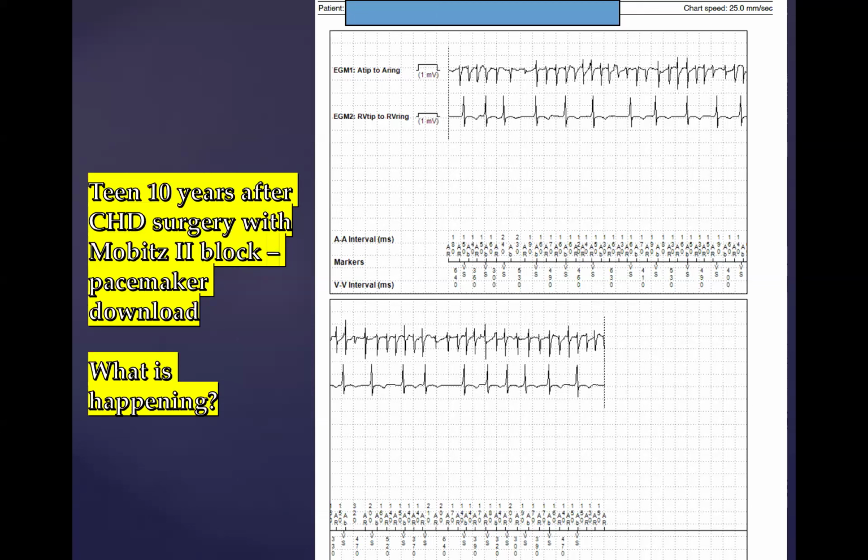Why do you think it is, Molly, that he doesn't know when he's in it? Because he has a pacemaker. Well, let me ask somebody who has heart block anyway. I don't know what his baseline pacing is, but in this tracing, is he actually pacing? No, not at all. His baseline is that he conducts on his own about 85% of the time, and rarely does not conduct. I remember this patient, many years ago, the pacemaker was put in because they were still having moments, like 12 days after surgery, where every 12th beat was not conducting, and we were nervous about it. There were 1 or 2 pauses.